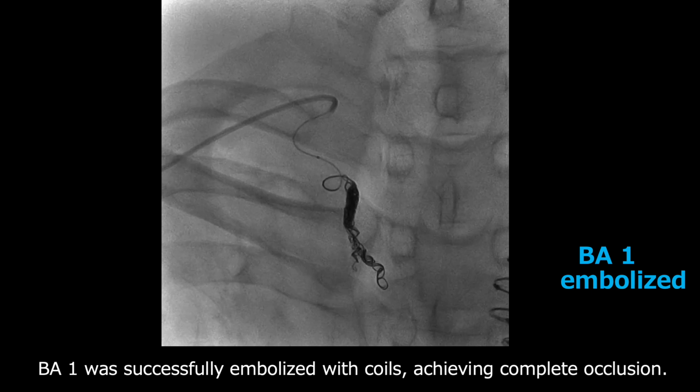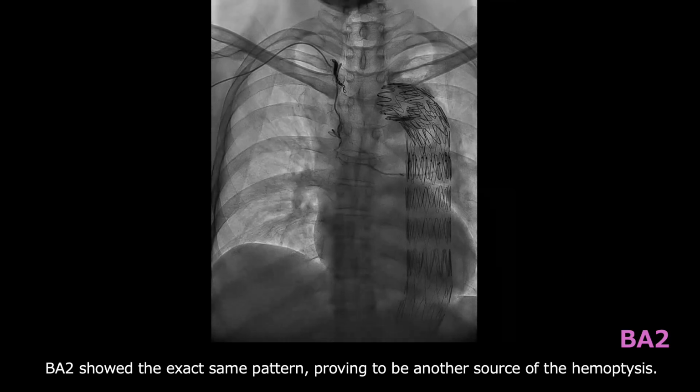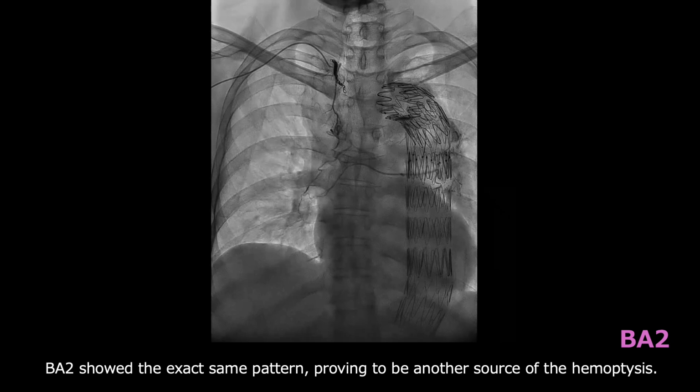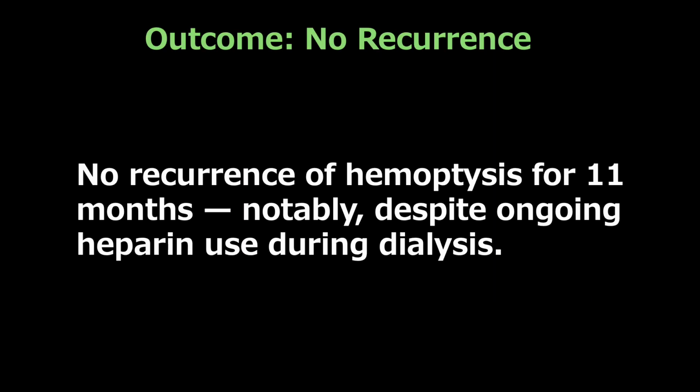BA1 was successfully embolized with coils. BA2 showed the exact same pattern, proving to be another source of the hemoptysis. Therefore, BA2 was also embolized. Let's look at the outcome. No recurrence of hemoptysis for 11 months. Let's move on to the discussion.